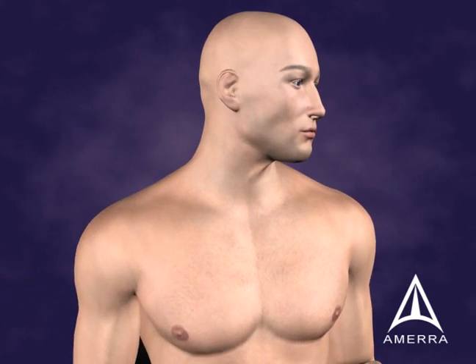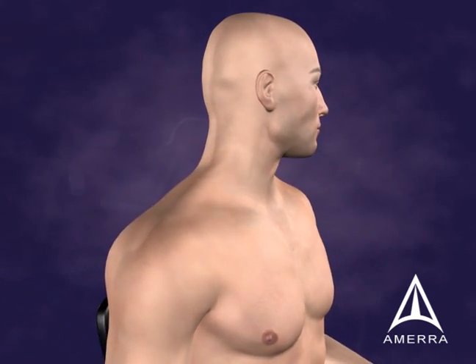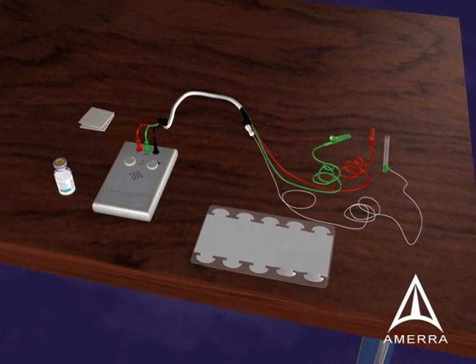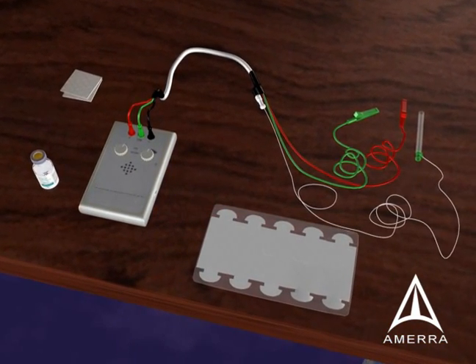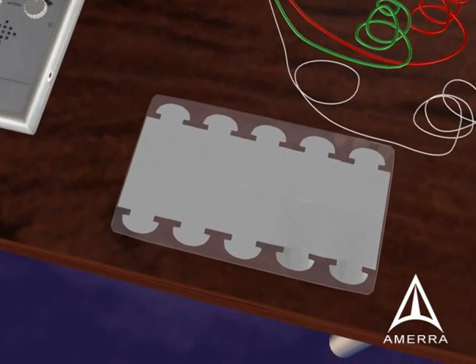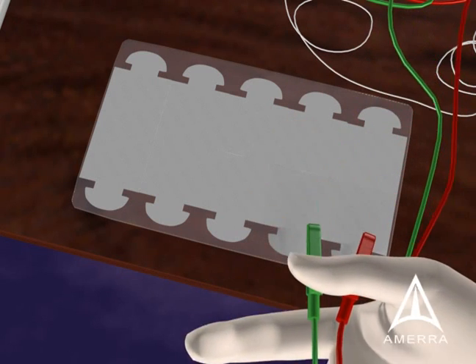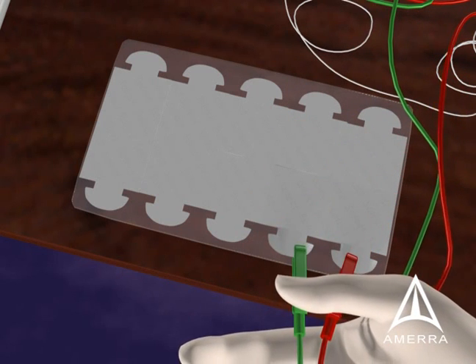In order to get started with the injection procedure utilizing EMG, a treating physician will need the EMG device, the electrodes including a ground and reference electrodes, as well as the chemodenervation needle to which the syringe attaches. An adhesive patch is utilized to attach the ground and reference leads to the skin.